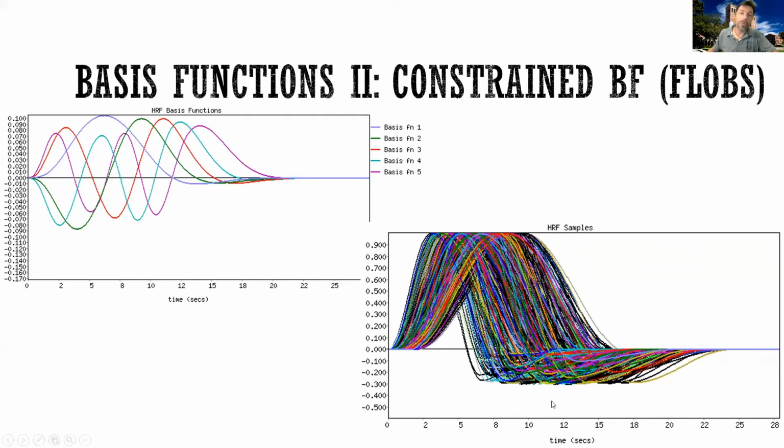So in a sense, they constrained the set of basis functions to what is plausible in the domain of hemodynamic responses. Look, the hemodynamic response is not going to go down and then zigzag up and down in straight lines. It's going to be something like one of these. And so FSL just thought, look, we can use these 5 functions. In fact, you could even use 3 and approximate pretty well most HRFs.